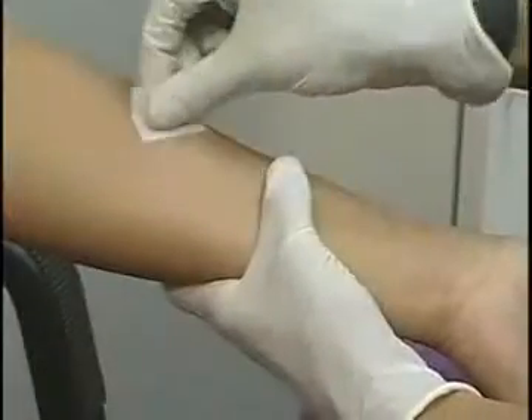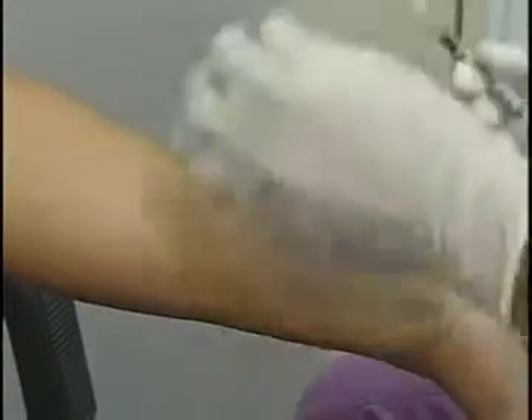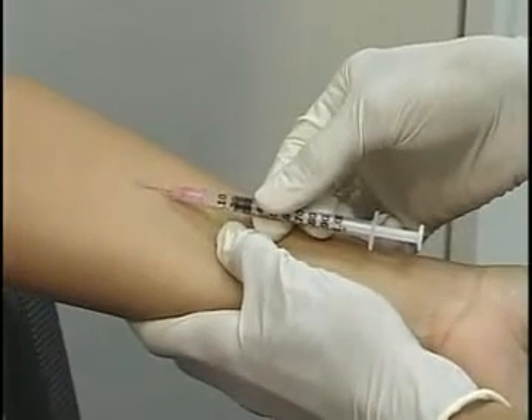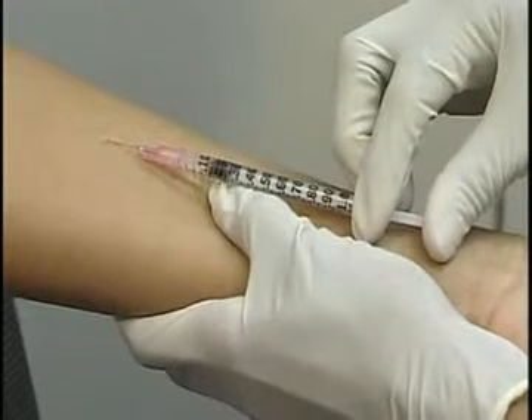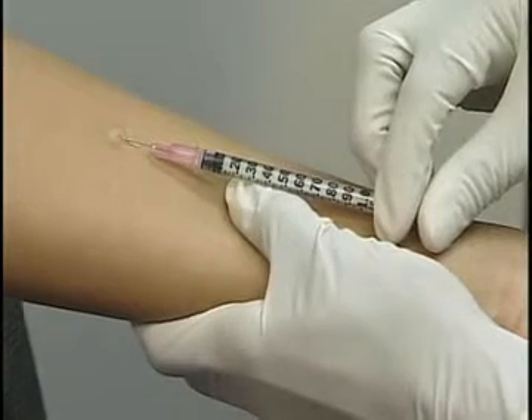This needle has a small amount of a harmless substance called PPD tuberculin. What I'm going to do next is inject this just under your skin. I'm holding the needle at a 10 to 15 degree angle because I don't want to inject too deeply. Well, that's good. At the site where I inject the medication, you'll notice a small bubble appear on your skin.